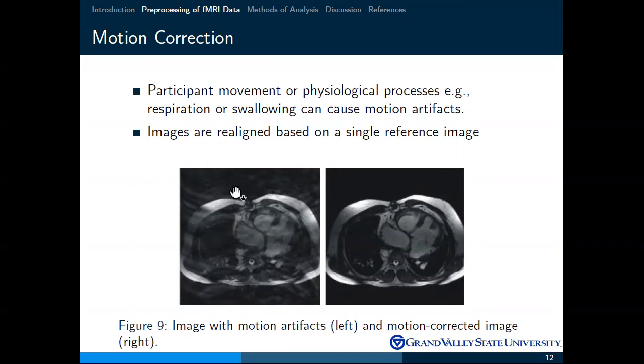So these can be removed using various statistical techniques like filters. And this is an interesting statistical problem in itself. How can we best represent the original image while removing these effects of movement prior to analysis? So this motion correction is commonly needed.